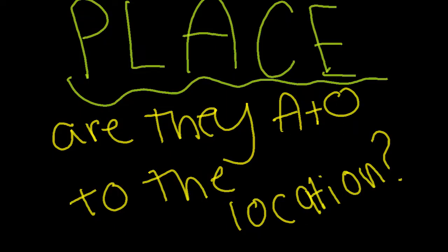This question tests if the patient is oriented to place, meaning it's testing if he knows where he is right now. Note, many patients who are not oriented to this may just ignore the question. I've had some patients that just won't answer you and will kind of look at you confused. But this patient in this example just gave the wrong answer. Also note that it's totally fine if you reorient the patient to what's going on. So this patient thought he was in his house, and I told him, you're in your dorm room. As long as you do it in a calm and straightforward way and you're not arguing with them or sounding annoyed, this is completely fine.